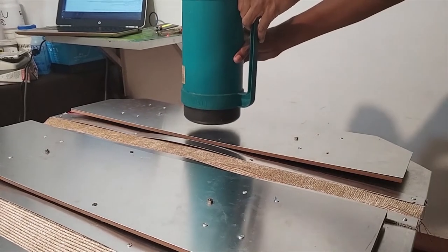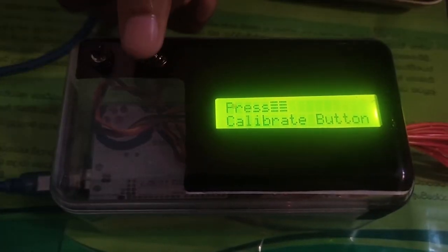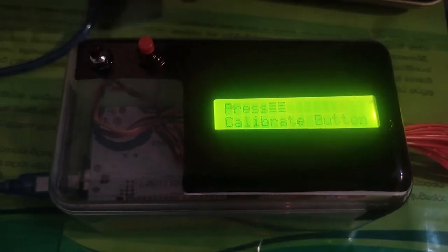Here you can see the device has six plates, and each plate needs to be calibrated for a predetermined weight disclosed by the manufacturer.